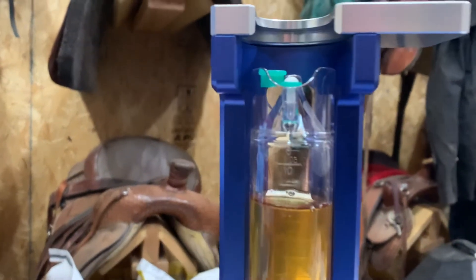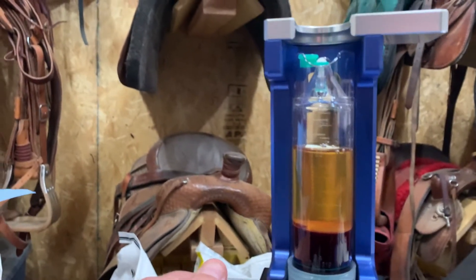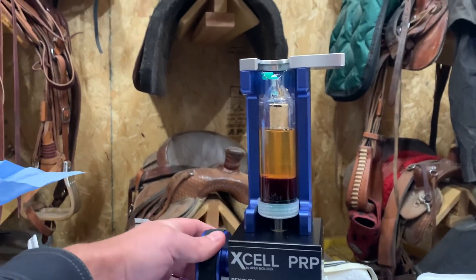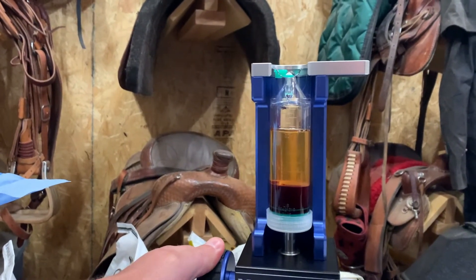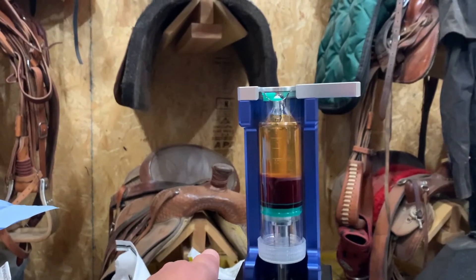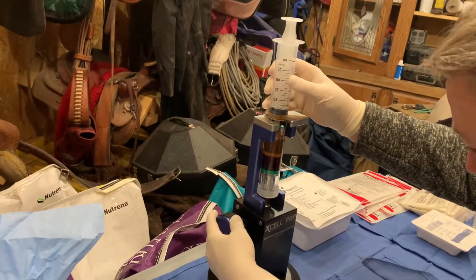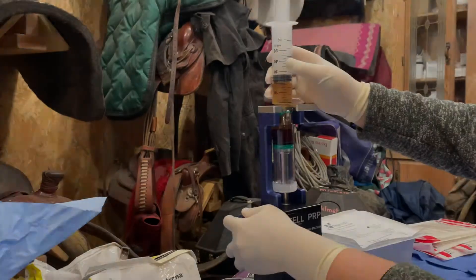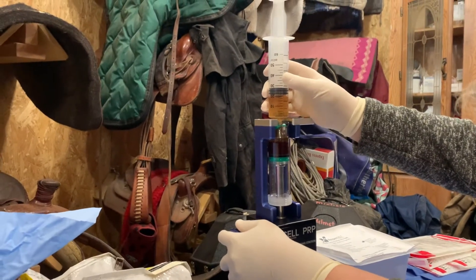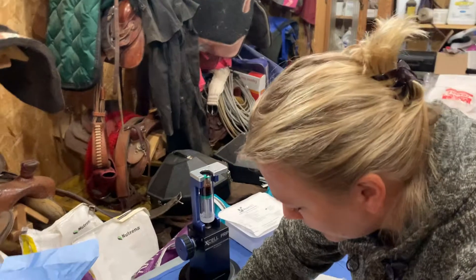The next thing we'll do is put it on the benchtop processing station, placing the concentration device on that. You'll see we want to bring that up to typically the six line. We'll slowly turn the dial until that locks in, then keep turning to the cone. We can stop once you see the buffy coat get up to the six. At this point, we'll take off the platelet-poor plasma and put a red cap on it.